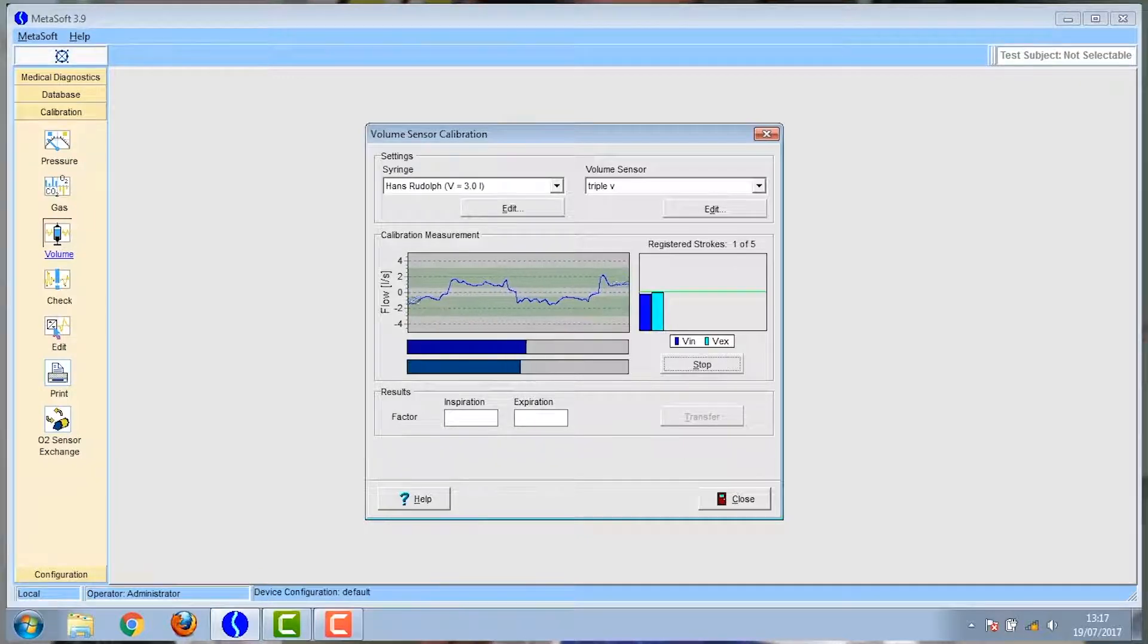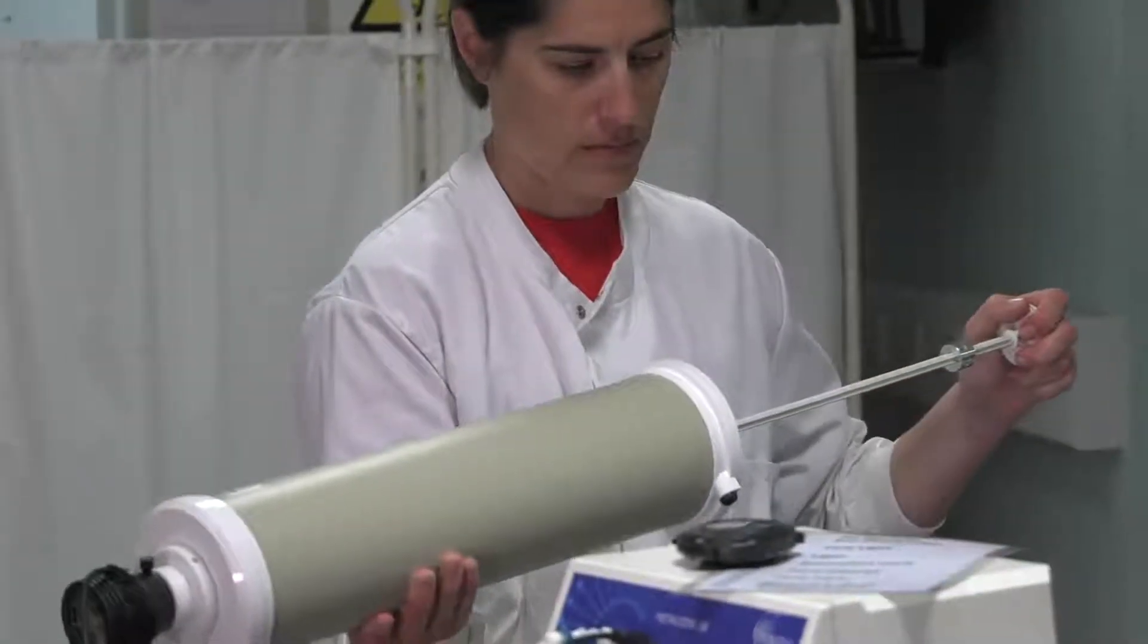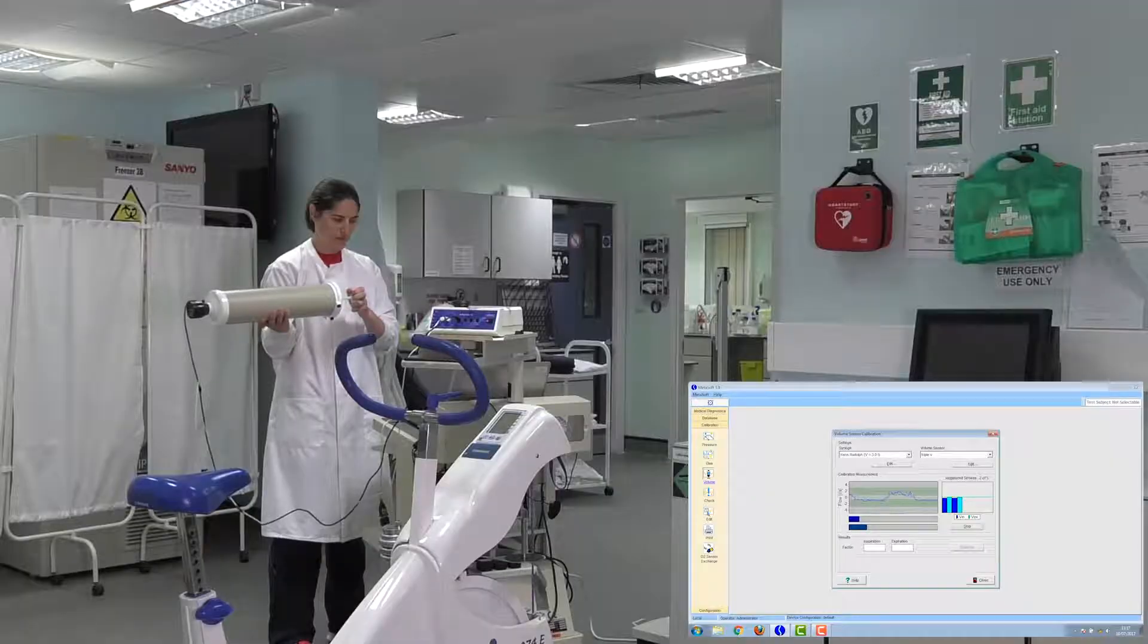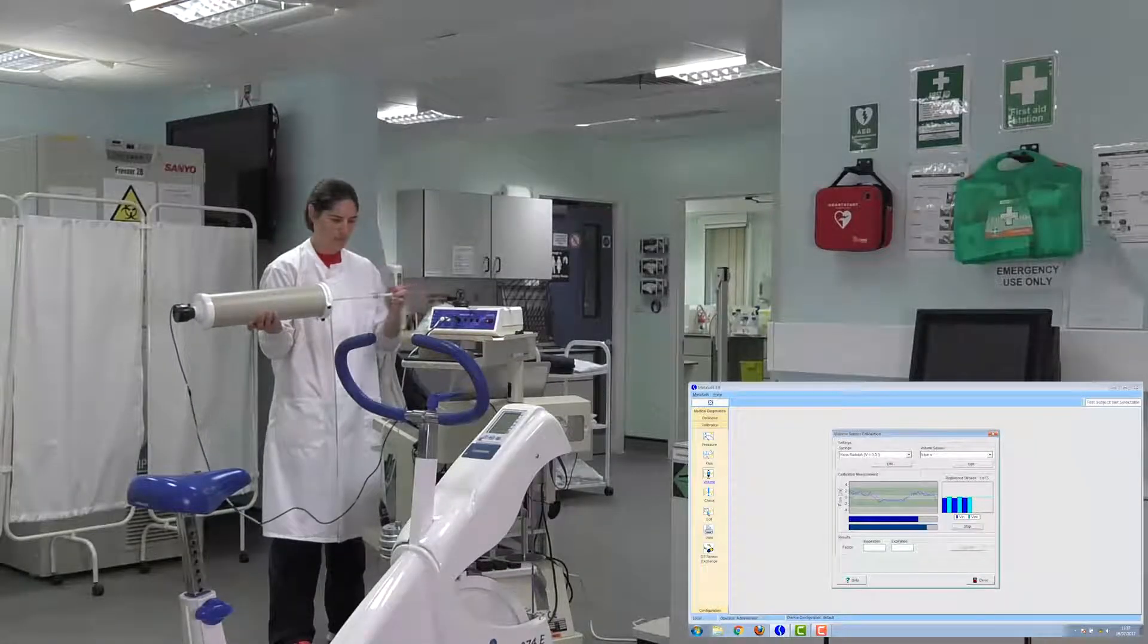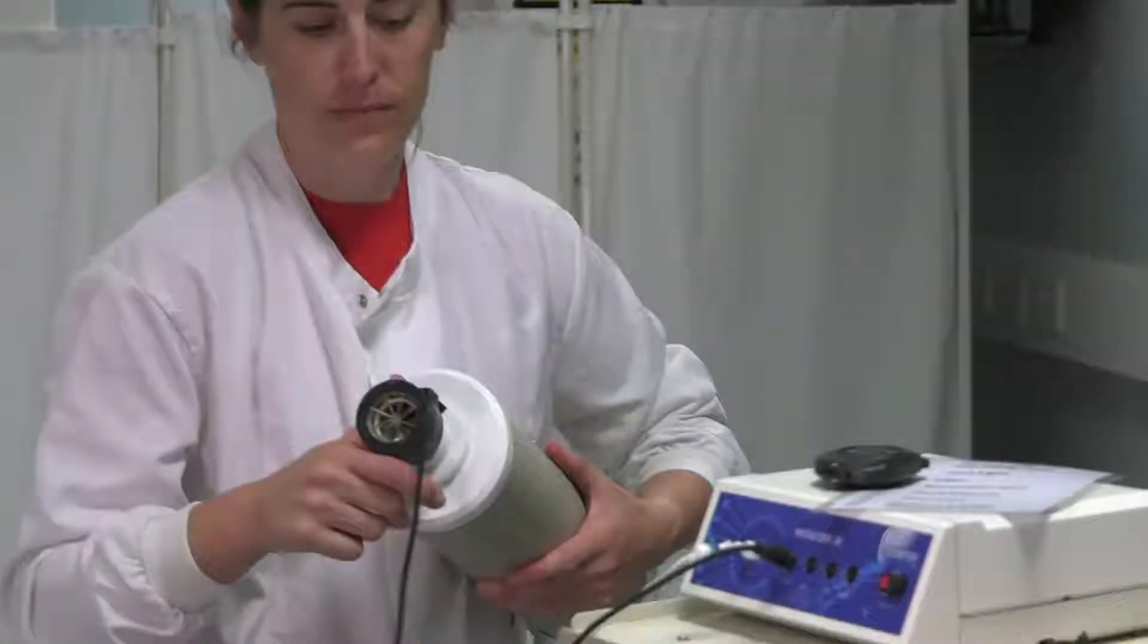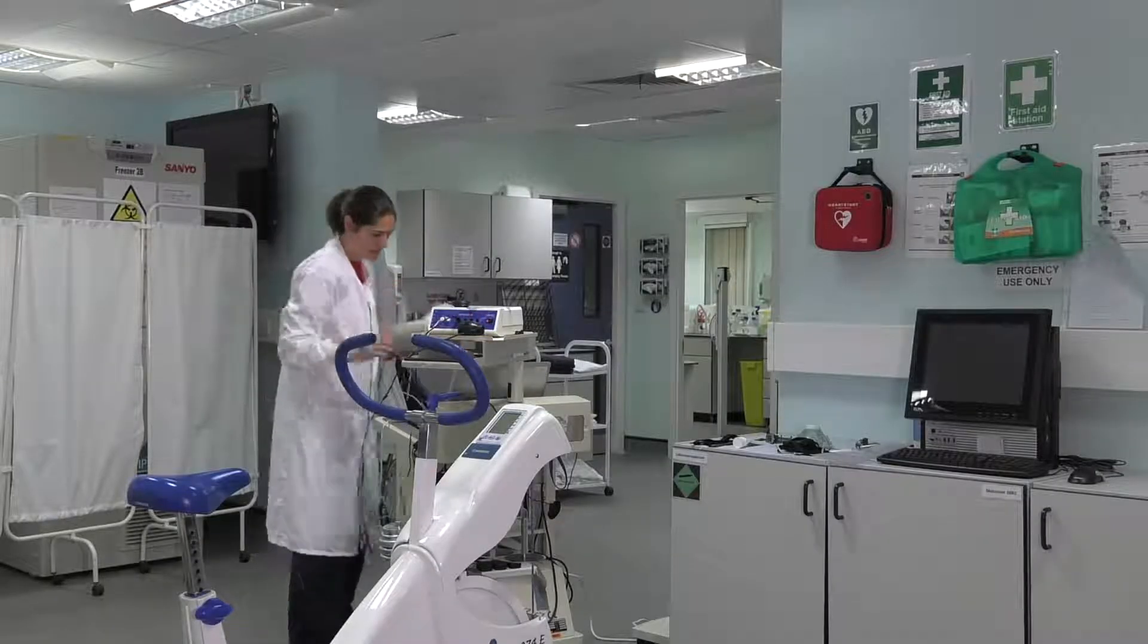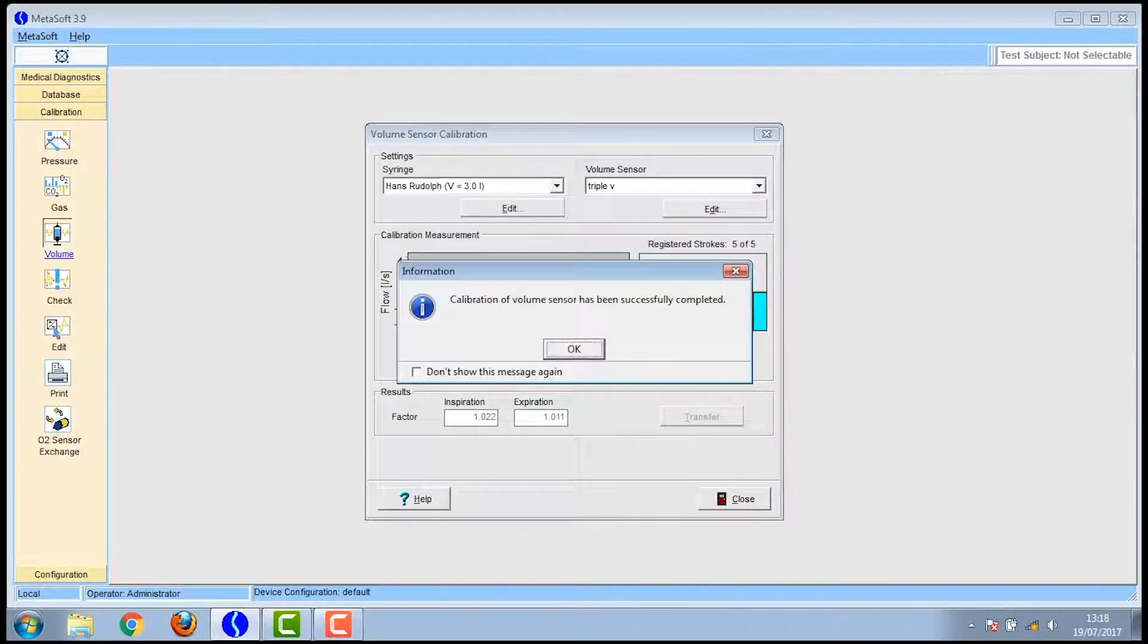Once you've done one that registers you'll see on the right hand side of the box two bars coming up and that shows that one stroke is registered. And you've got to get five of them but they will only register if you're in time to the bars moving. Once completed you can click on transfer and then you click close.